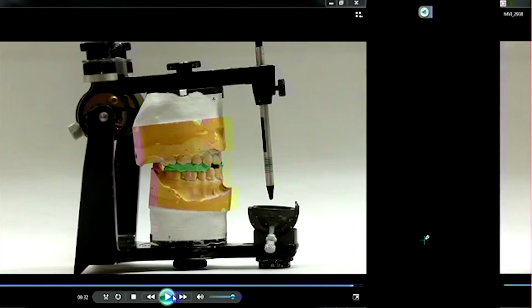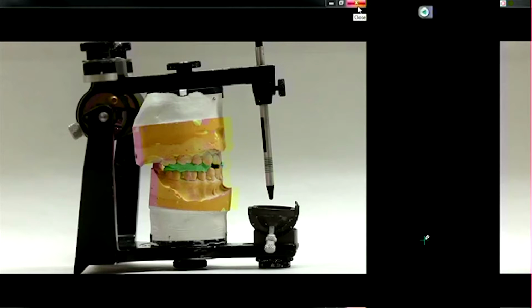Okay? Does that make sense? Okay. So the angle that you toggle it to, when those teeth are fully seated in, then we can assume that that is the patient's condylar inclination. So I will say on these articulators that you guys have, your Whip Mix 2240s, it's a little harder to do. But that's sort of the principle. Okay? So if you really wanted to, you can program the articulator to the patient's exact, or you can program it a little closer to what the patient has.